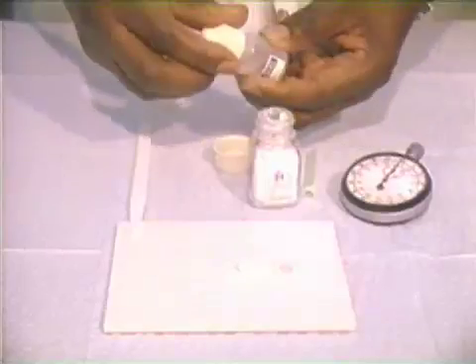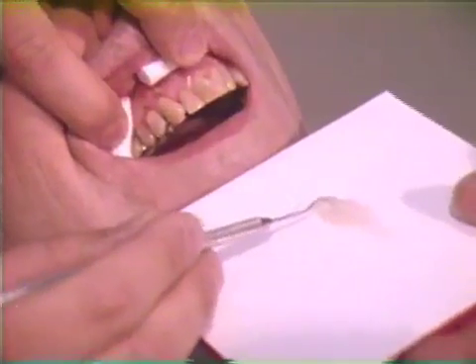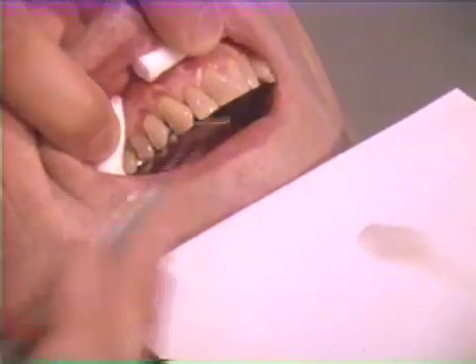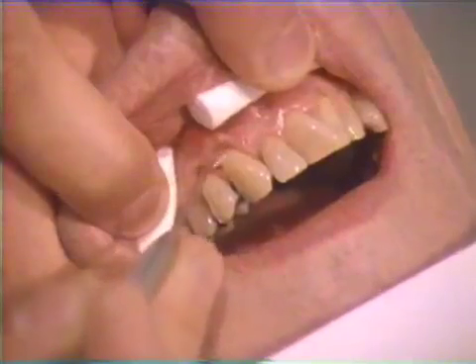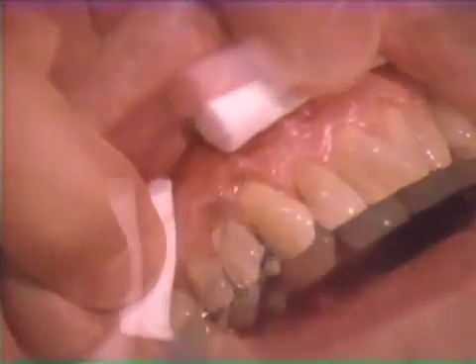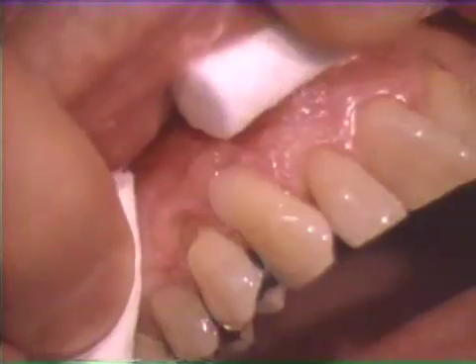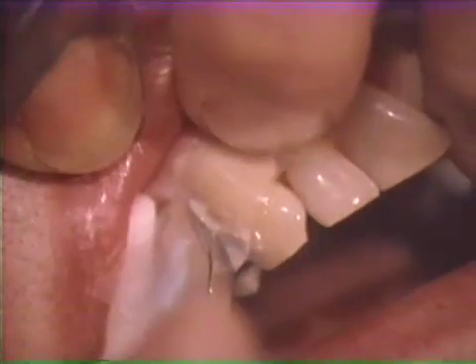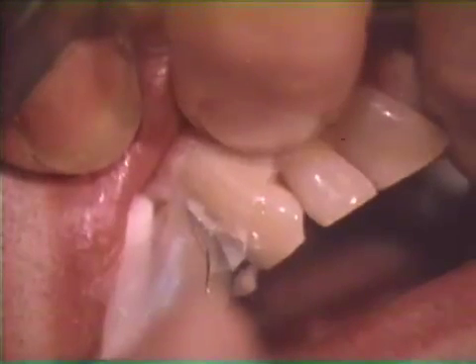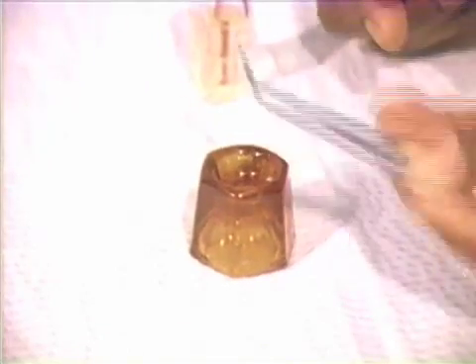Following shade selection, the materials are proportioned and spatulated together according to the manufacturer's directions. The mixed and ready-to-use material should be less viscous than a usual composite mix. Complete isolation from salivary contamination during placement of the glass ionomer material is mandatory. Although less desirable, only cotton roll isolation rather than rubber dam will be used in this example. Correctly blended restorative material is incrementally placed onto the appropriate tooth area using a suitable instrument. Once the cavity is slightly overfilled, the material is held under pressure using a mylar strip.